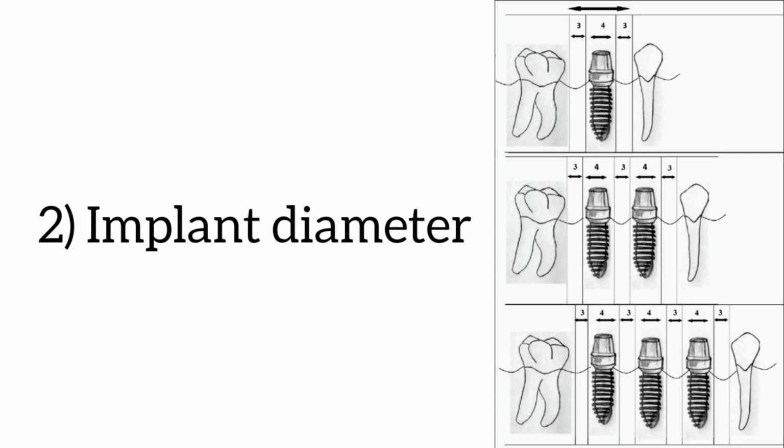Like implant length, long implants have more surface interface between implant and the bone, thereby improving the implant's initial stability. Implant diameter usually, greater diameter affords better distribution of load.